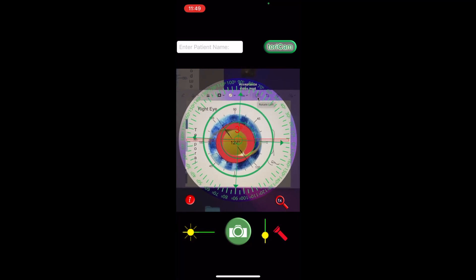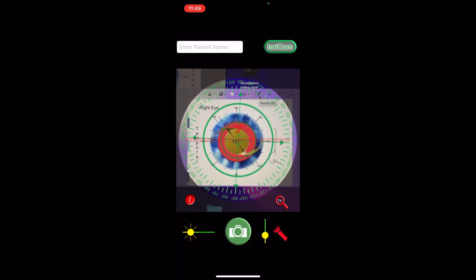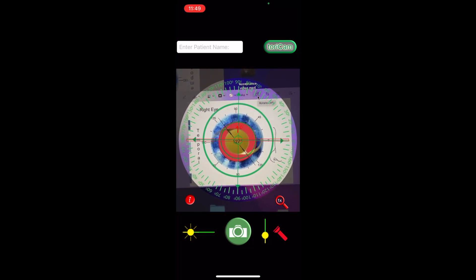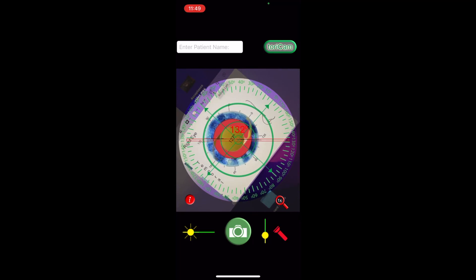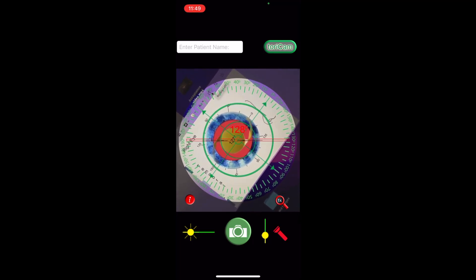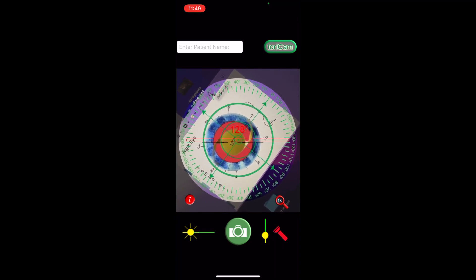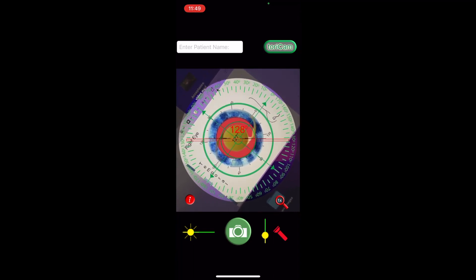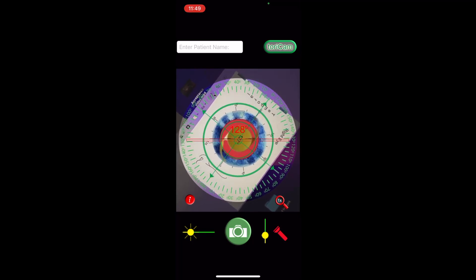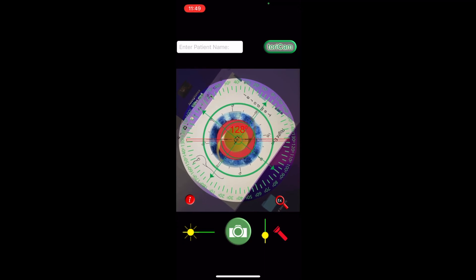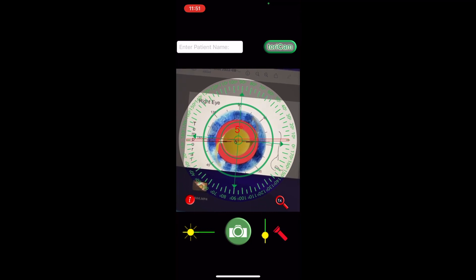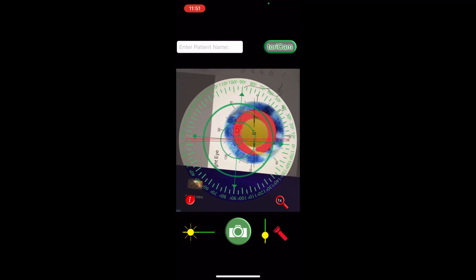If the surgery is recorded upside down, the question is whether the use of TORIC M app will change the calculation. This surgery is upright-recorded and the TORIC M axis is aligned to the axis on the image — let's flip the image just to see what happens. Flipping the image upside down does not change the orientation of the axis. As another example, at 5 degrees, flipping does not change the orientation.